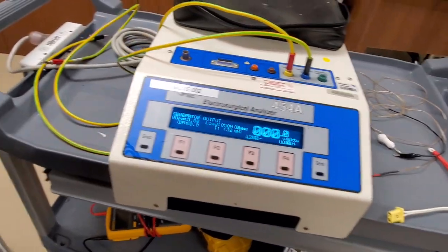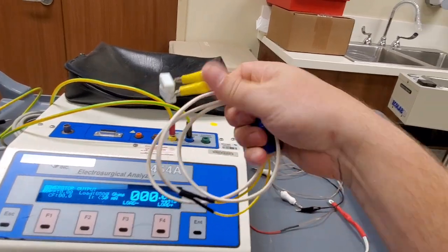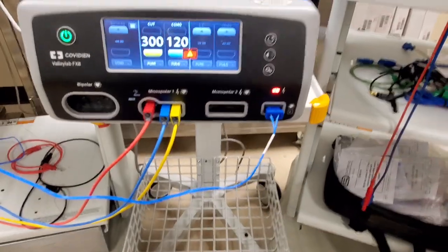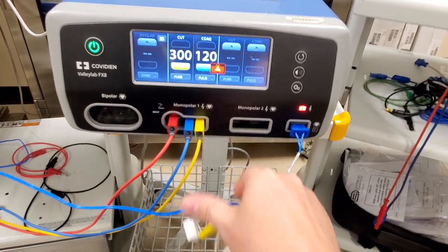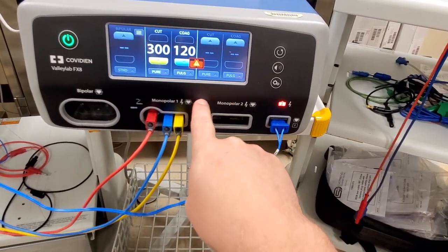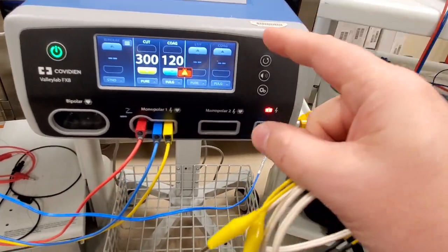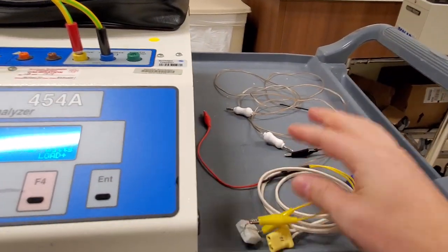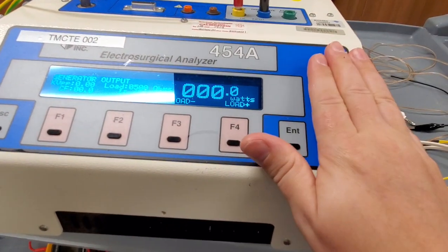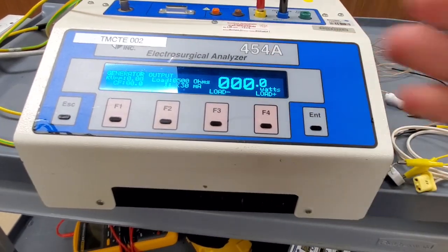It's got big, large, easy-to-read displays at an angle so you can read it while sitting comfortably. This unit is the standard because it's simple - it has all the information where you need it when you need it. The only real reason I need to replace this unit is because it didn't have an integral load for the newest ESUs. To get it to activate, you need a load of about 10 ohms to simulate a patient on the split lead, so I made up my own load using two 5-watt resistors wired in parallel.